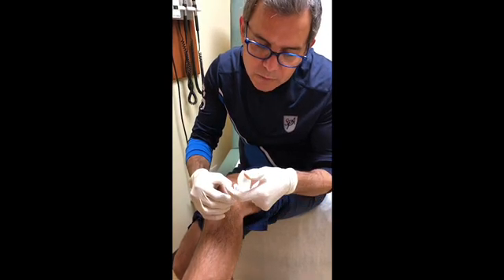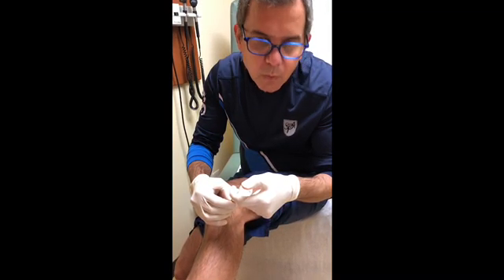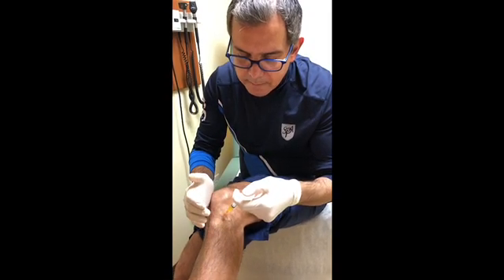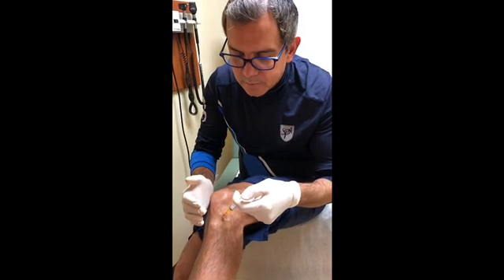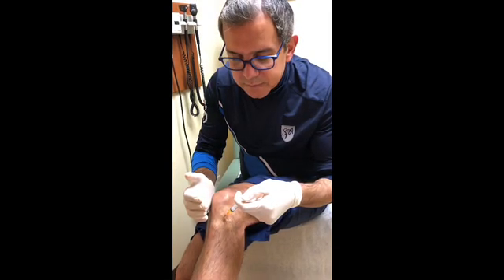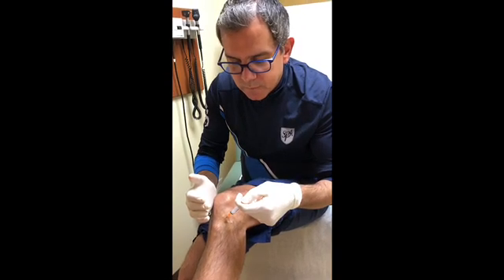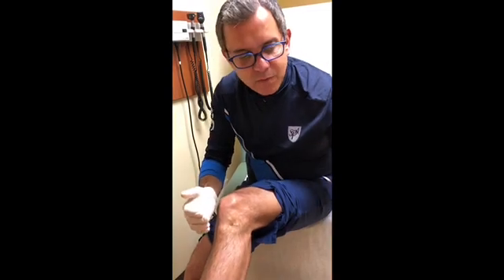Pain level about 1 out of 10. You just feel that something is being injected. No pain whatsoever at this time. We'll wait and we'll see what happens.